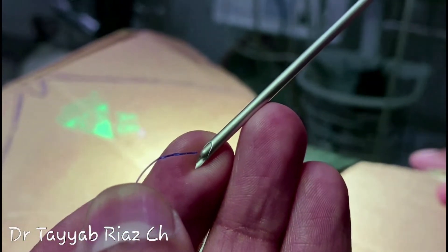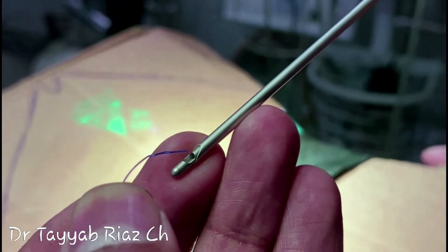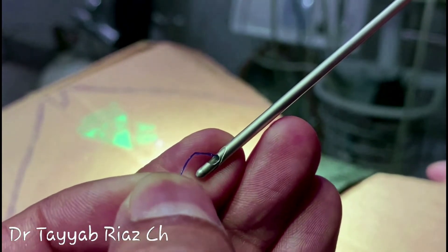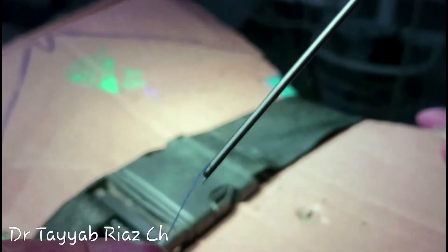The only action needed is to pull and release the stilet of the needle with one hand, and meanwhile you can feed the end of the thread into the side eye of the needle and release it respectively with the help of the other hand. You will notice it is tightly gripped.